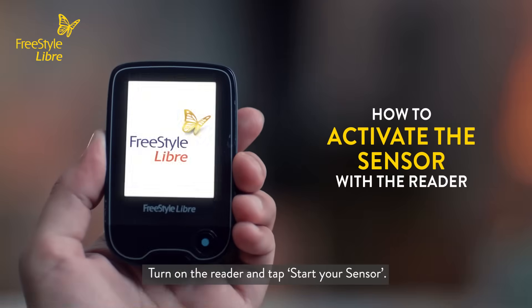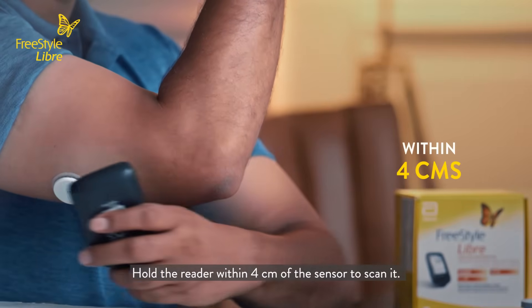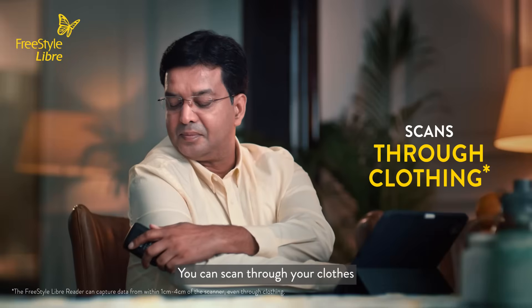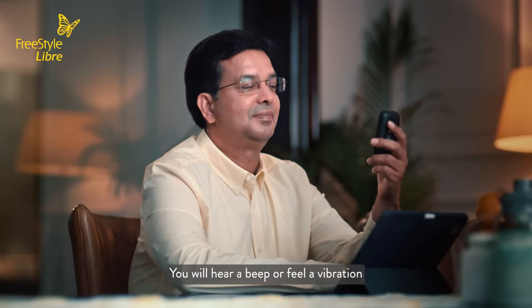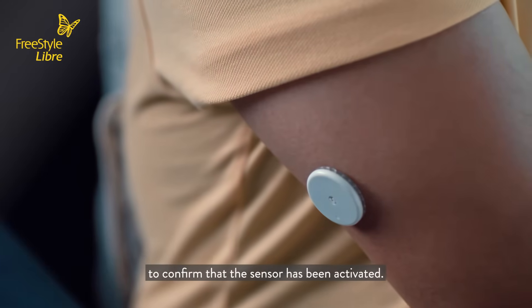Turn on the reader and tap 'Start your sensor.' Hold the reader within four centimeters of the sensor to scan it. You can scan through your clothes and use the front or back of the reader. You will hear a beep or feel a vibration to confirm that the sensor has been activated.